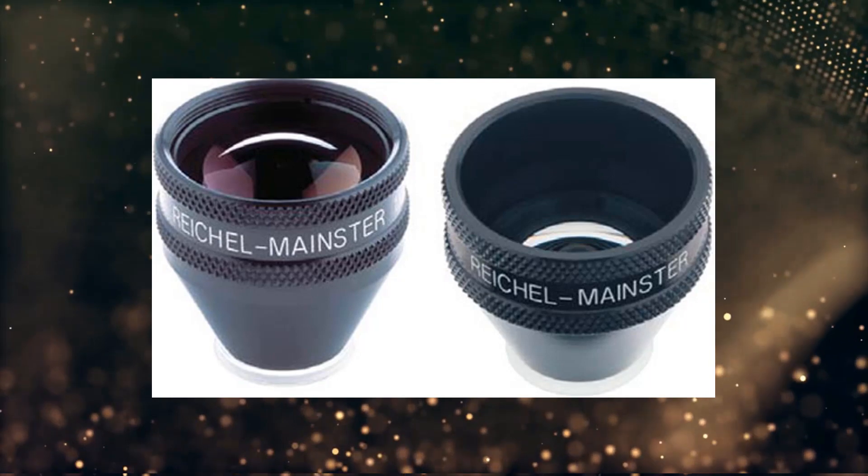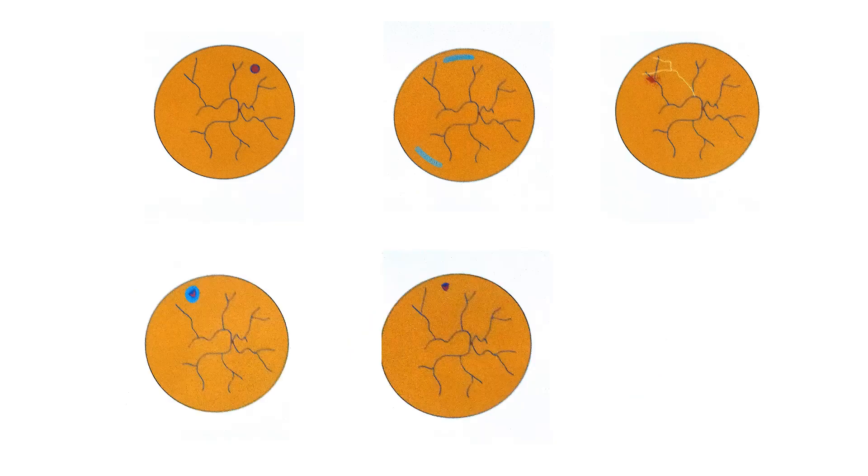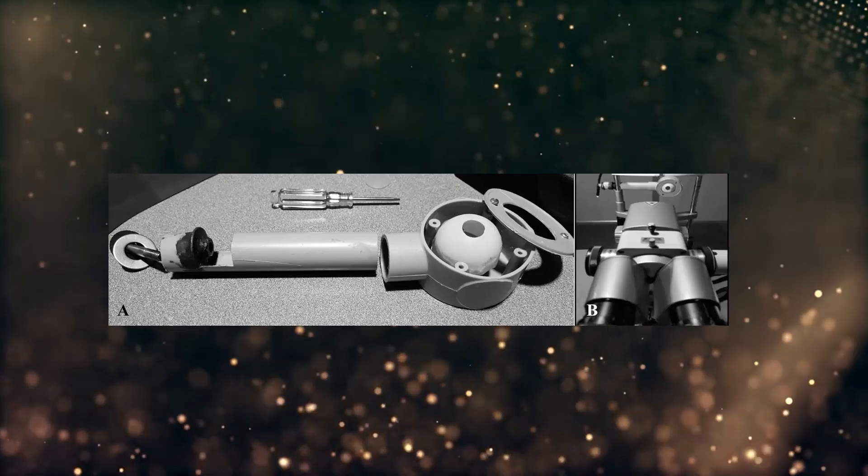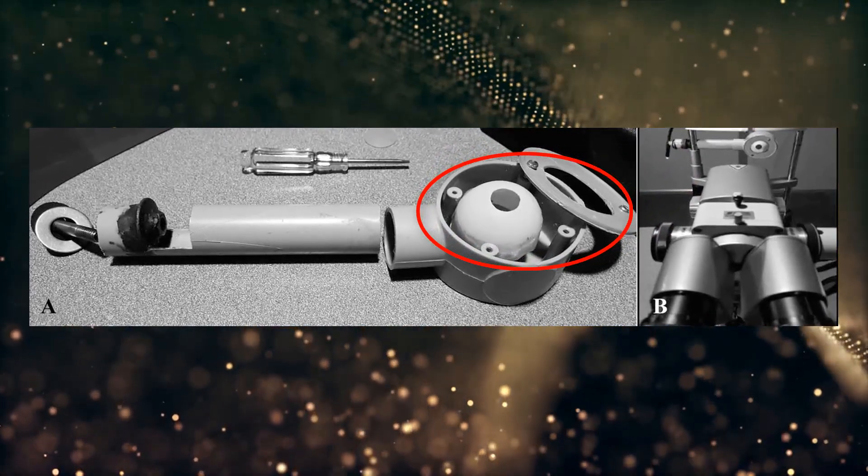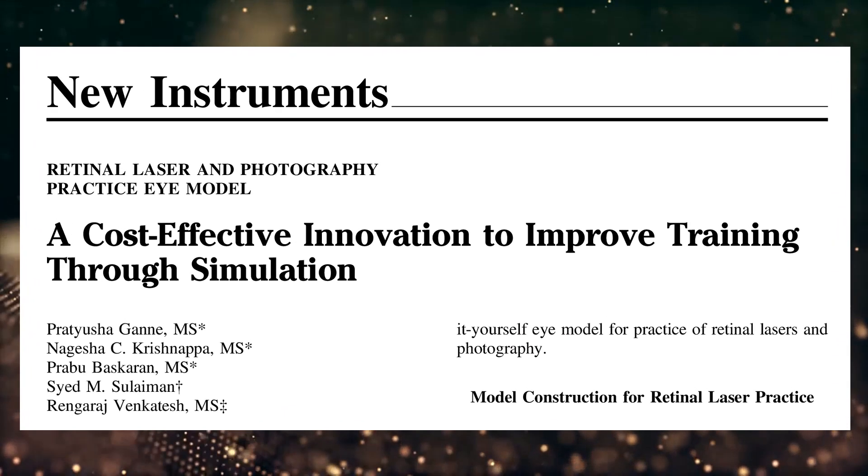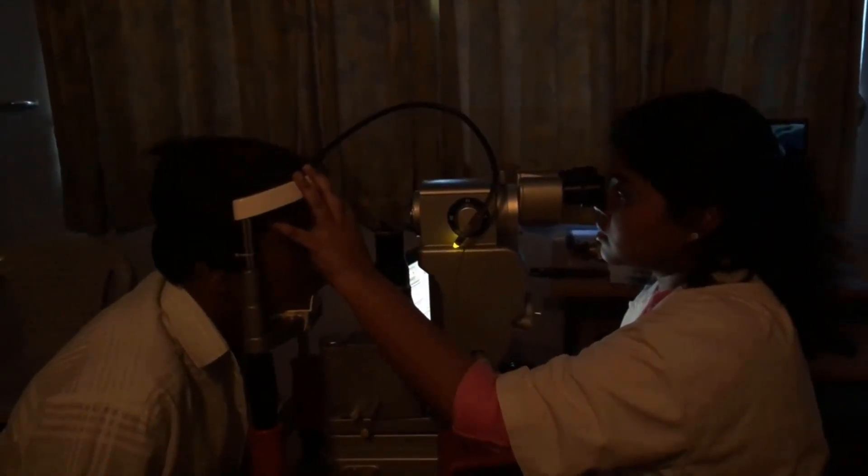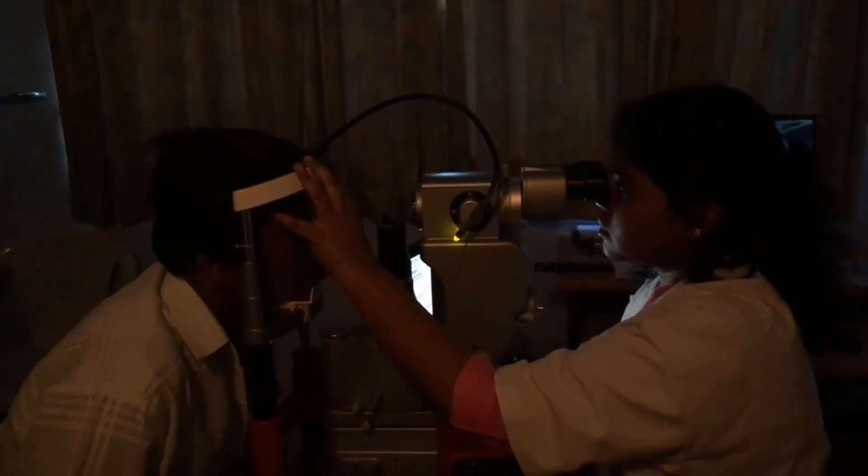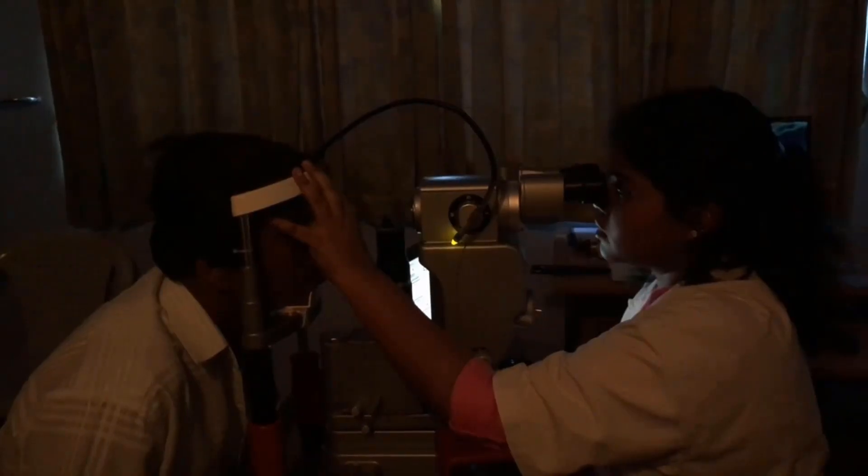A regular contact lens for laser photocoagulation is used to practice lasers. The used retinal film can be replaced by a new one in the same framework. A discarded electrical junction box with a hole in the lid and the plastic tube at the other end is used. It is very cost-effective and the burns produced resemble those on human retina and power settings are comparable to real-life scenario. Focal, grid, and barrage lasers can also be practiced on the same.